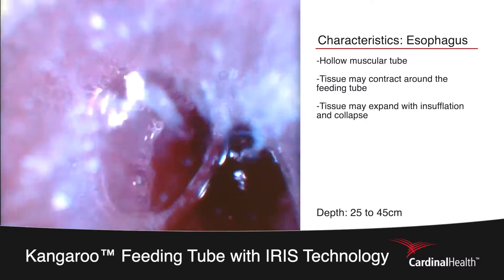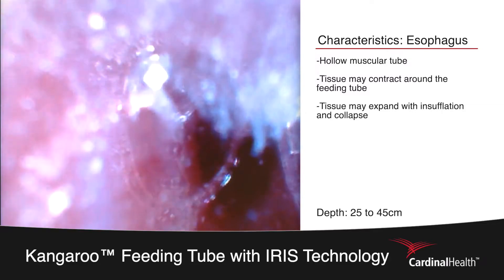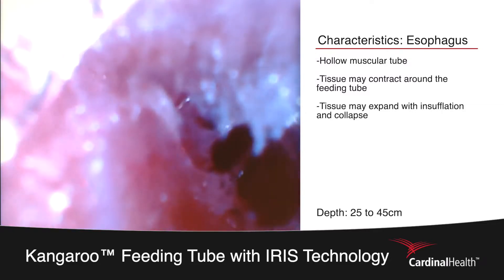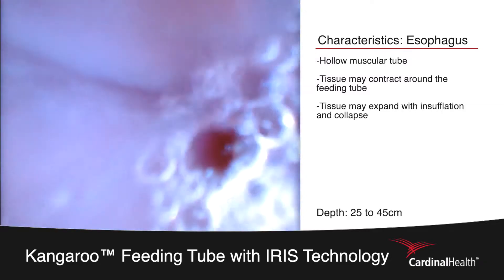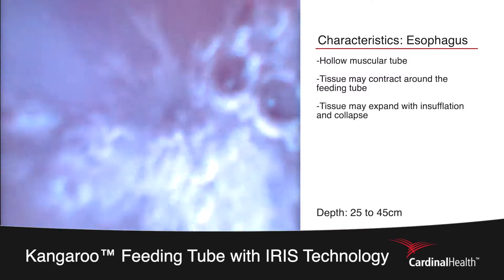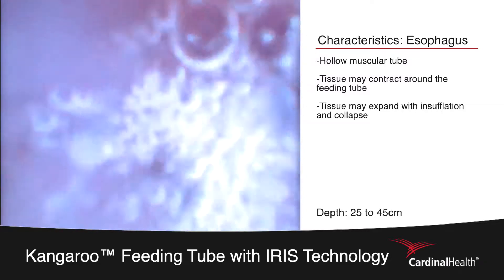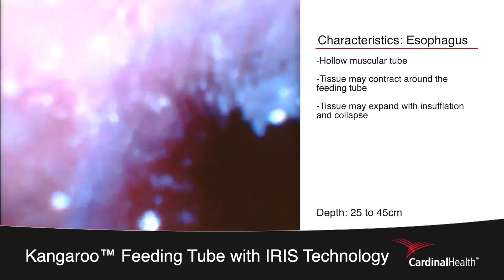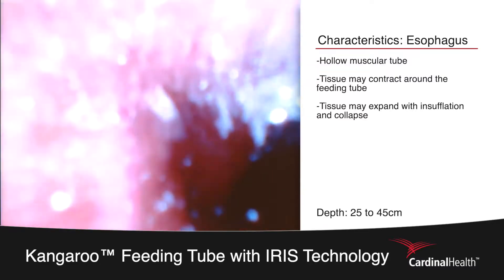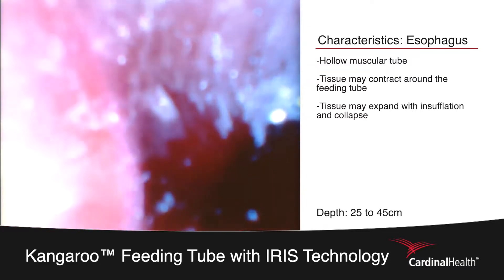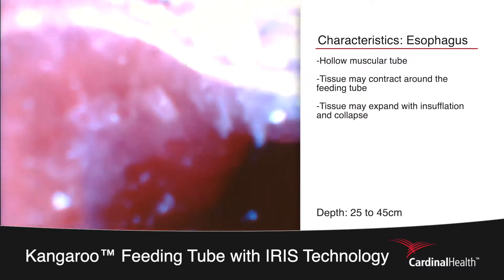You will be looking for the tissue of the esophagus to contract around the tip of the feeding tube. You can utilize the insufflation bulb to add air and create space to ensure you are in the esophagus, as can be seen here.